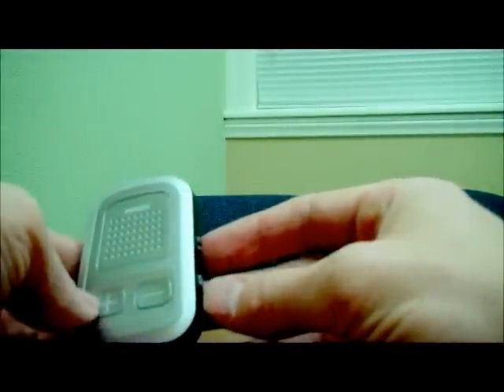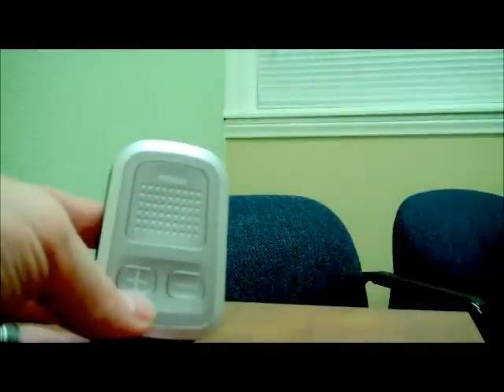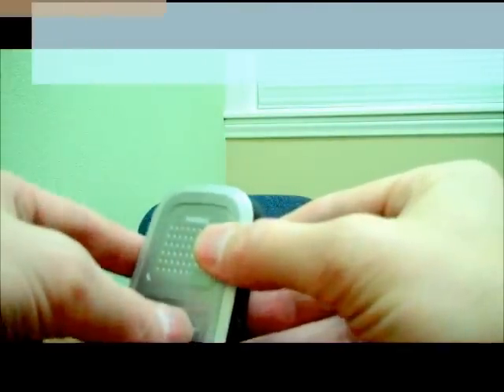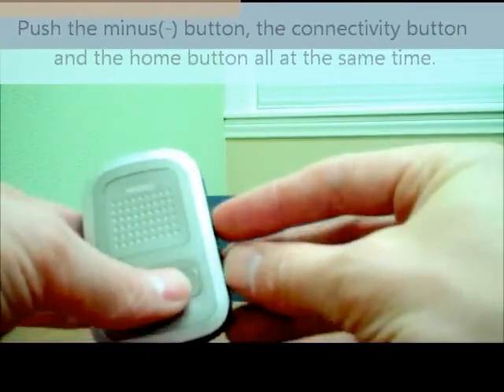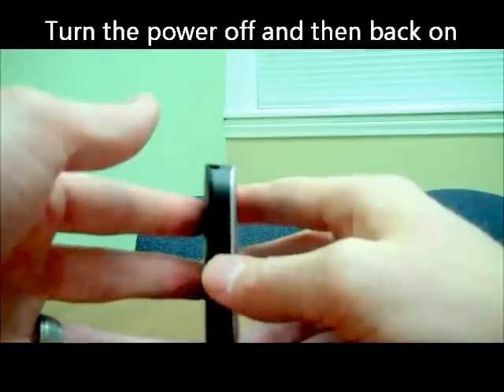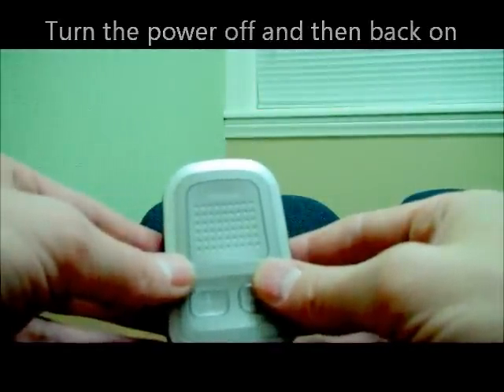Now something else I wanted to show was how to reset this. You would reset it if it's not functioning properly — you can't get it to reprogram to your phone, you can't get it to pair to your phone or communicate with the hearing aids. To reset it, push the minus button, the connectivity button, and the home button all at the same time and hold that down for three seconds. Then flip the power switch off and turn it back on. Now this is completely reset, so it is not paired to anything in particular.